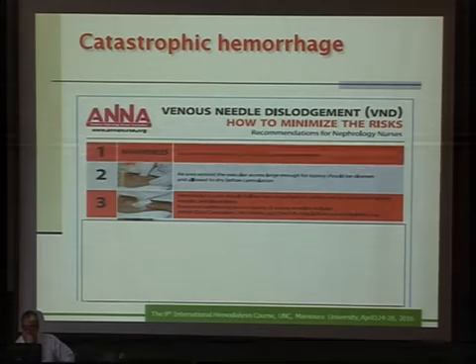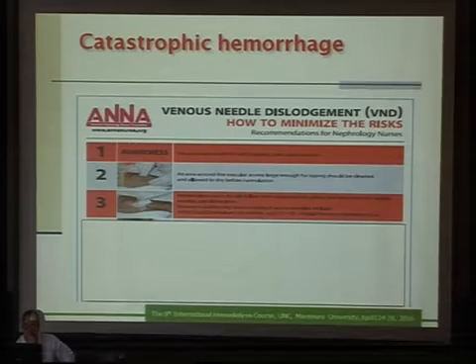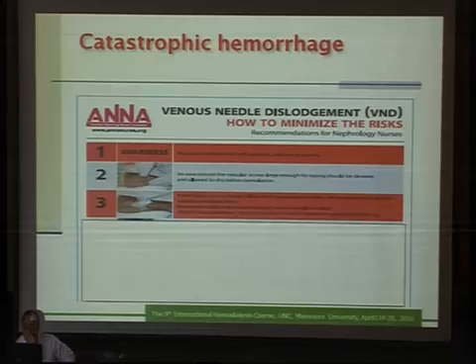The hemodialysis unit should follow their organization policy and procedure, and I think Professor Samir Saleh on the first day advised and stressed that each dialysis unit should have its own manual that should be strictly followed.